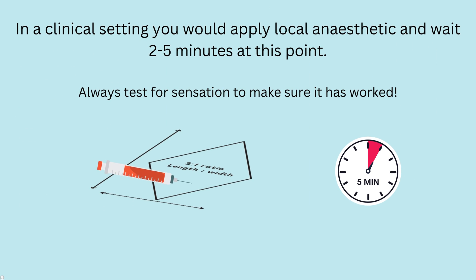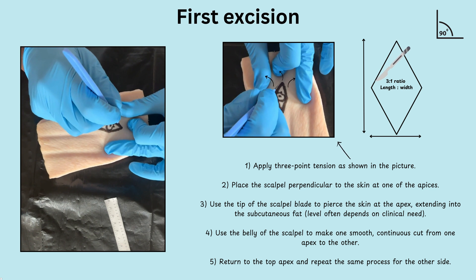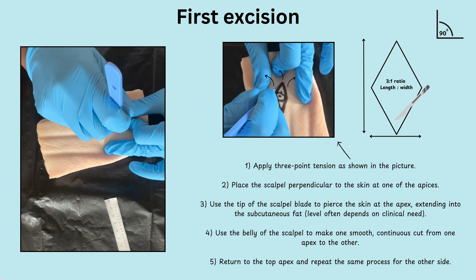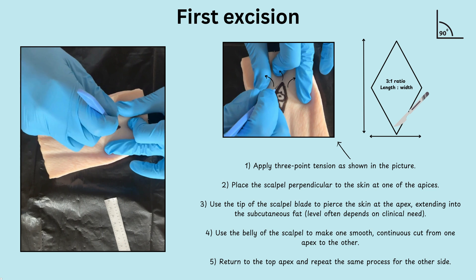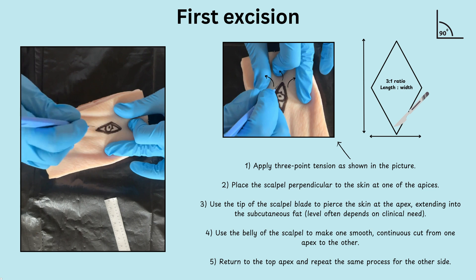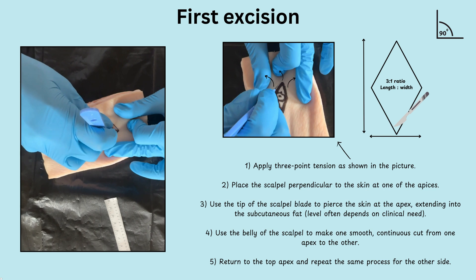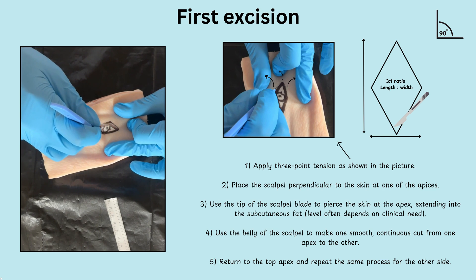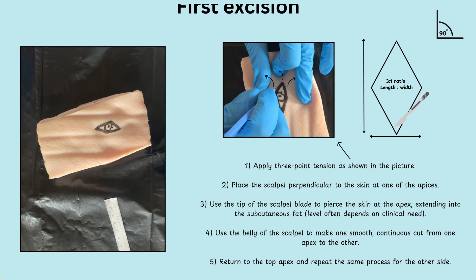In a clinical setting, provide local anaesthetic using a field block both intradermally and subcutaneously. Apply three-point tension around the ellipse, and hold the scalpel so that the blade is 90 degrees perpendicular to the skin. Using the tip of the blade, pierce into the skin and use the belly of the scalpel to cut through, following the lines of your drawn ellipse. Ideally you want one smooth continuous pass from one apex to the other. The depth of the cut should be down to the subcutaneous fat; you can repeat over the same cut if you need to go deeper.